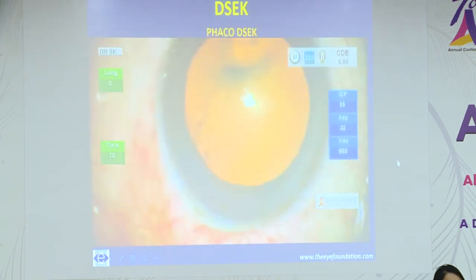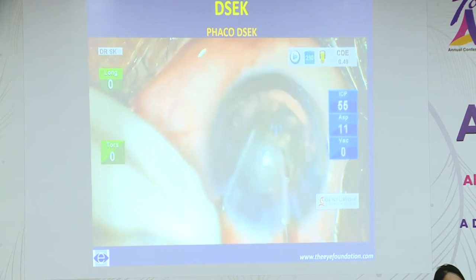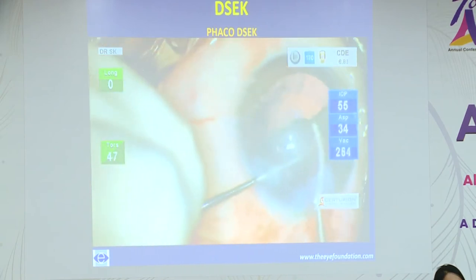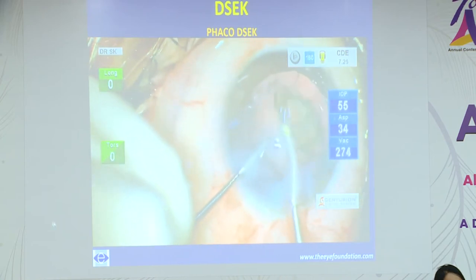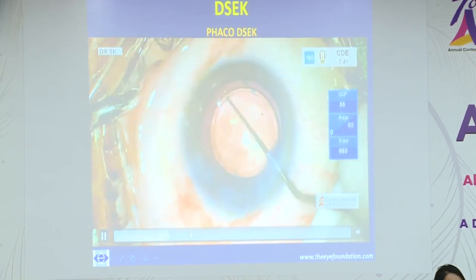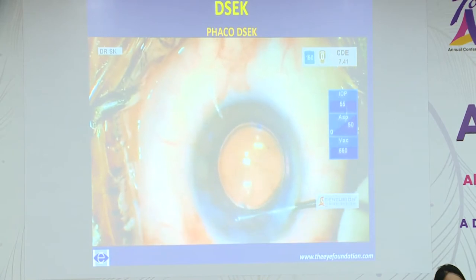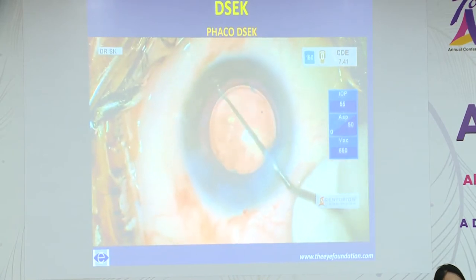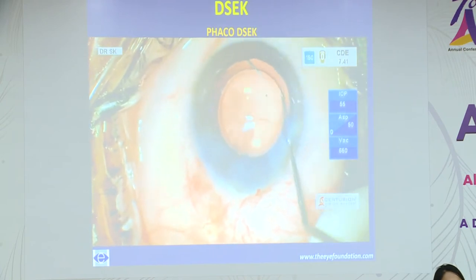So the next is the recipient preparation. This is a case of DSEK stage 2. The patient is symptomatic with a few bullae on the cornea. I'm combining it with phacoemulsification. Once the phaco is done, place the lens in the bag, and then strip the endothelium. You do this in certain patients, not in all the cases.